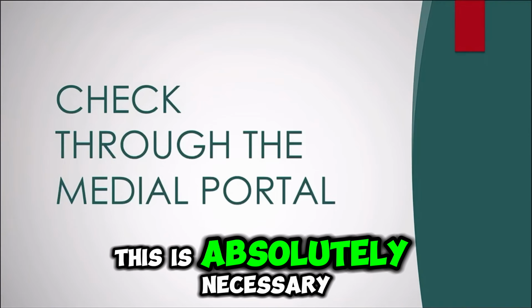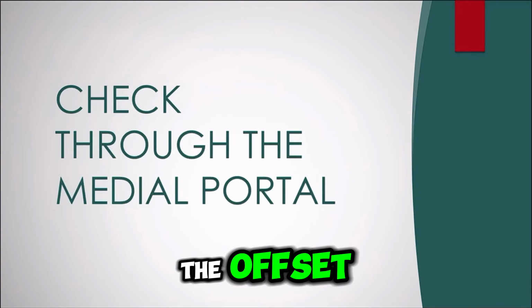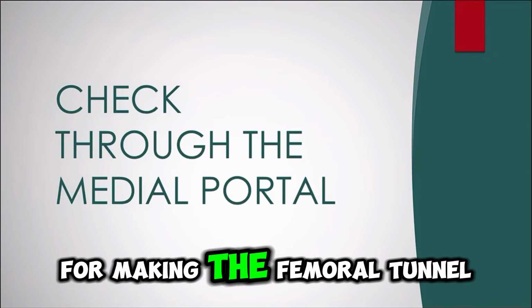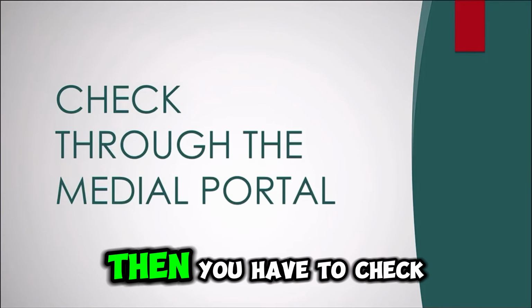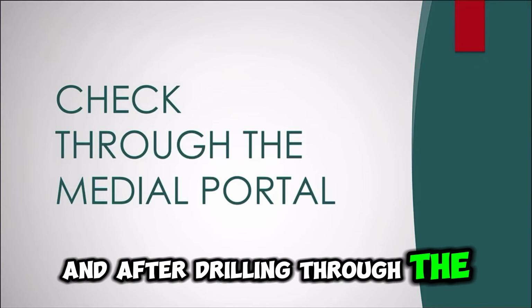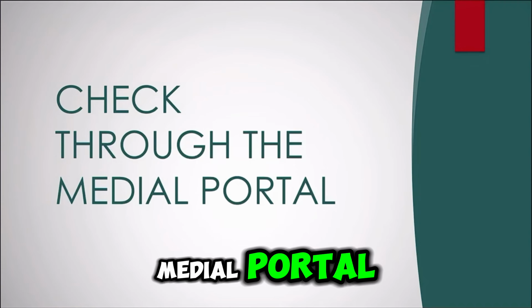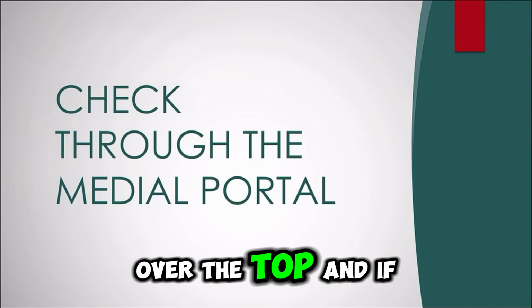This is absolutely necessary if you are not using the offset. If you are not using femoral offset for making the femoral tunnel, first make the initial mark, then you have to check through the medial portal, and after drilling with the 4.5 mm drill bit, again check through the medial portal that you are sufficiently anterior to the over the top.